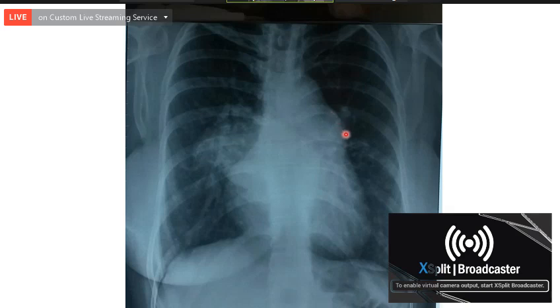What is this? Calcification. Where is the calcification? Pulmonary artery, main pulmonary artery. No, it's not the main pulmonary. You can see two parallel calcifications. PDA, sir. Yeah, PDA. It's a calcified PDA, and the PDA is extending from the aorta somewhere in the posterior portion to the pulmonary artery, or near the junction of the pulmonary artery with the left pulmonary artery.